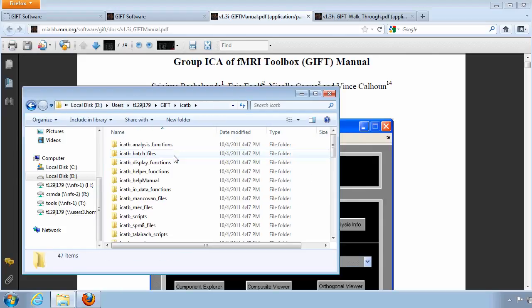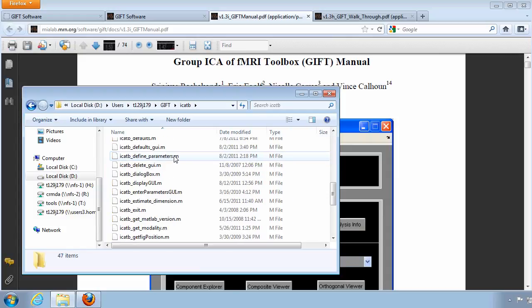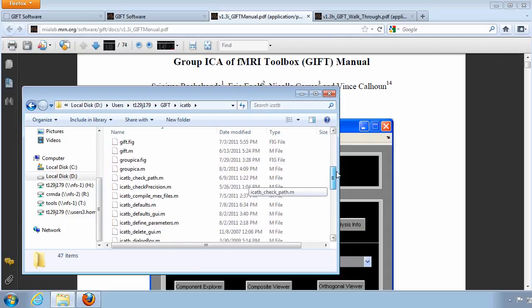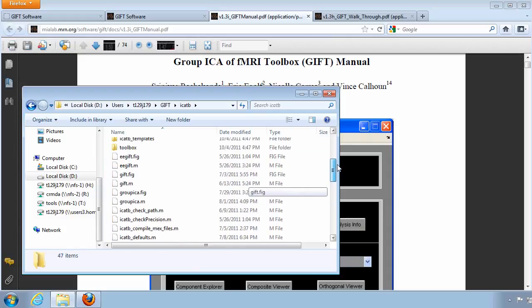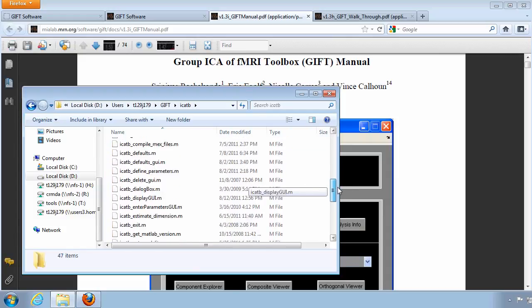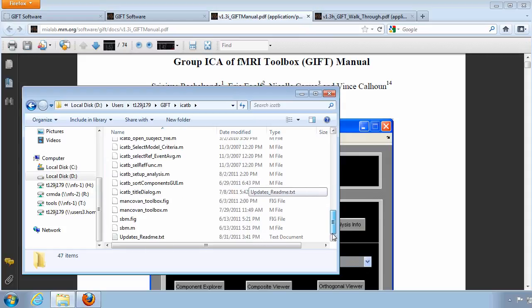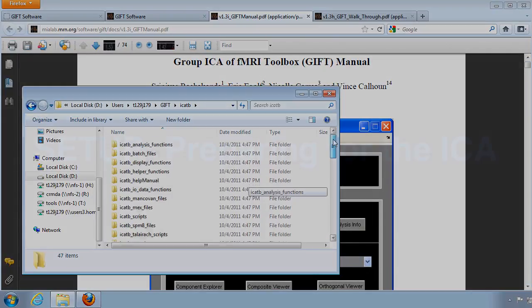The ICATB folder stands for ICA Toolbox, and it stores all of the MATLAB programs. You will not need to add to or change anything in this folder.